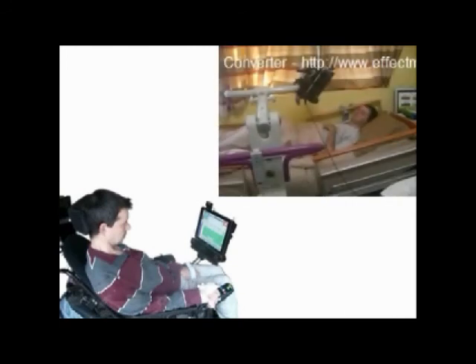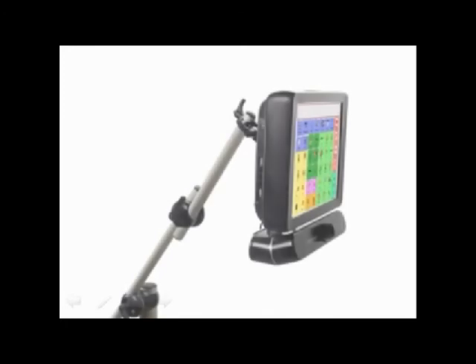The system is mounted to my wheelchair throughout the day, and at night it is put on a mount clamp to my hoist so I can use it in bed. The system isn't flawless. It is pretty stable, but it does freeze occasionally. I currently have a switch that will restart the system if it does freeze. I have built a device for the switch so it will only restart the computer if I do a double hit. This is to minimize the risk of the computer restarting when I don't want it to.